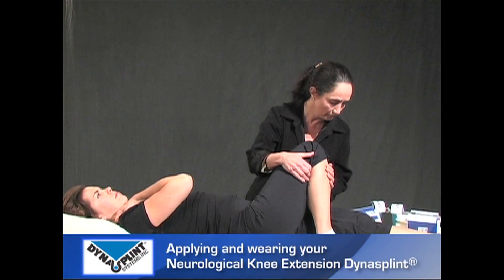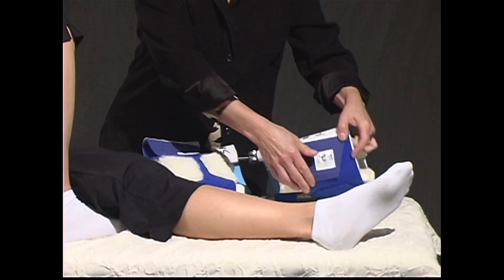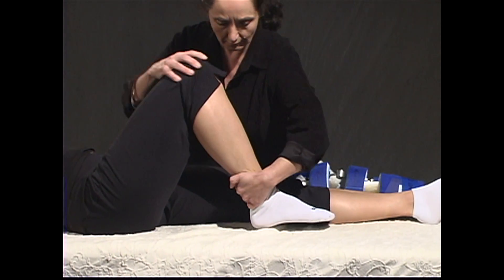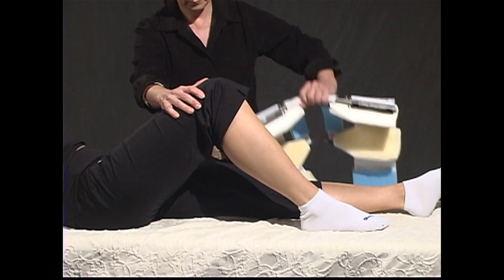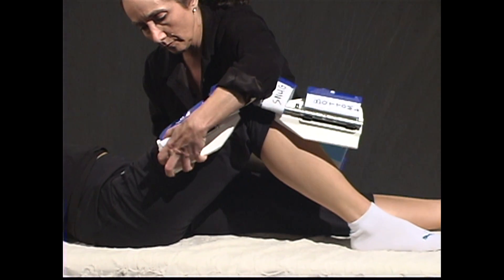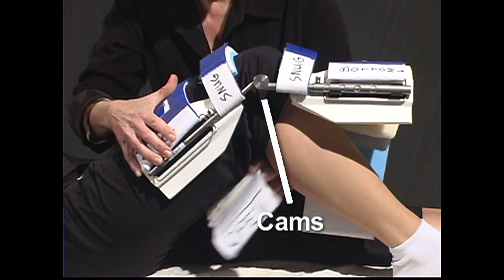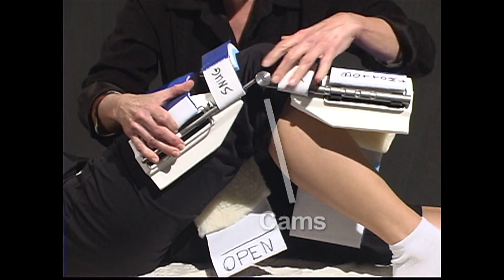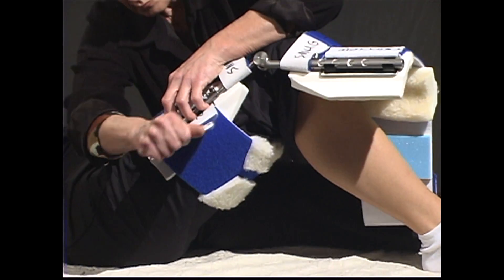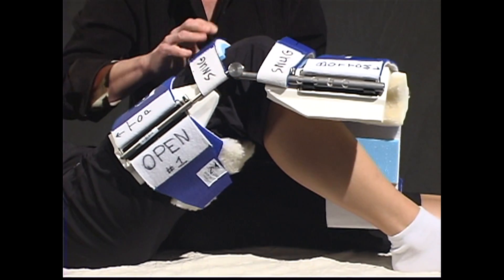With the patient lying in a reclined position, open the back of the thigh and calf cuffs. Stretch the patient's knee out gently. Take the DynaSplint and hang it over the knee between the two-inch blue straps. Make sure the round metal cams align with the middle of the knee joint. Insert the top of the thigh cuff through the D-ring and pull it over until you see the line drawn by the DynaSplint consultant.